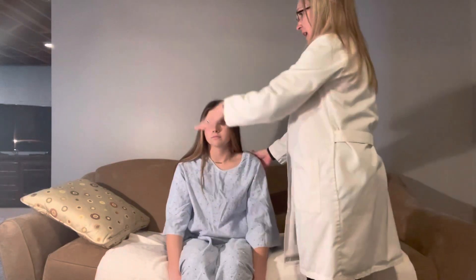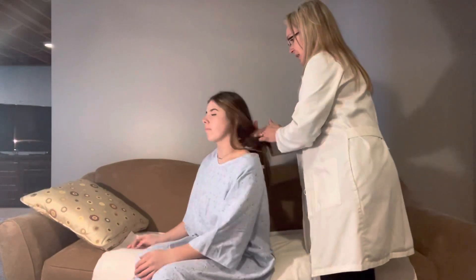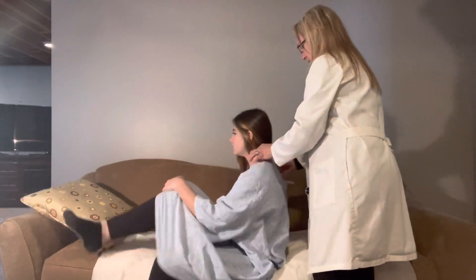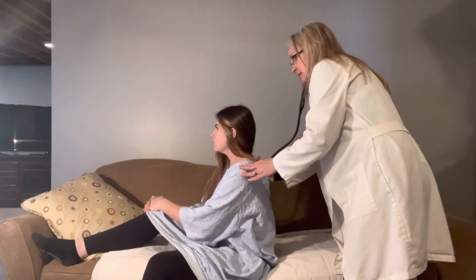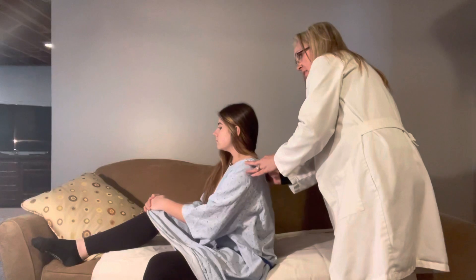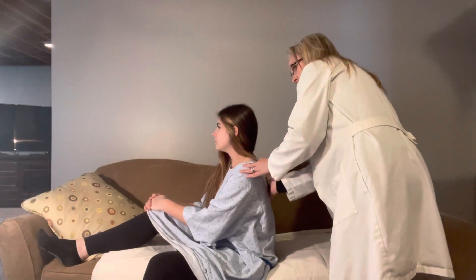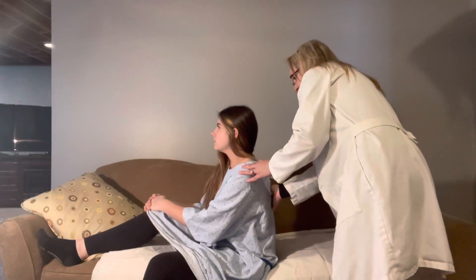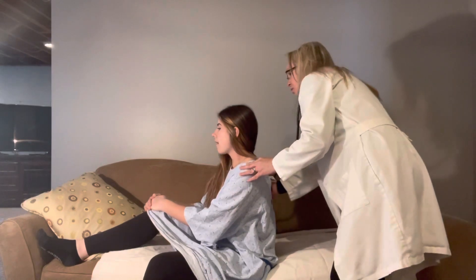I'm going to have you sit and angle towards that way and take a listen. Nice deep breath in and out. Nice and clear breath sounds — I don't hear anything abnormal, I don't feel any crepitus.